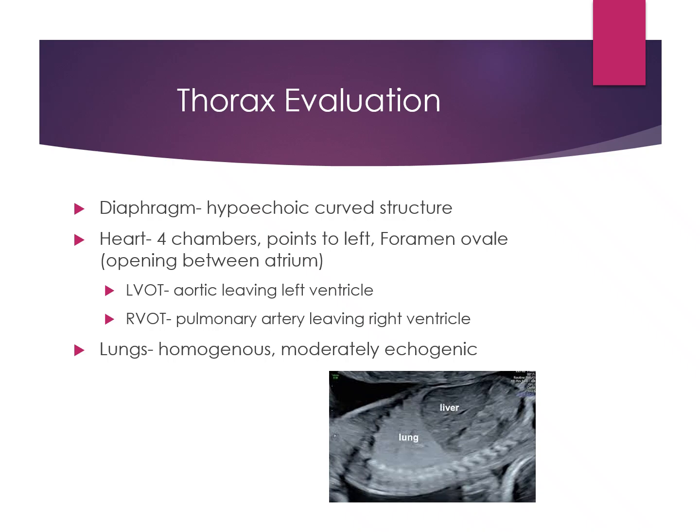So below the diaphragm, we're going to see that liver. And so not even knowing anything else other than that, you can tell that we have a liver here, right? We have lung here. This is going to be the superior portion of the baby, and then this separation between the two of them that drapes down is going to be our diaphragm. So in one picture, we have our lungs and we have our diaphragm.